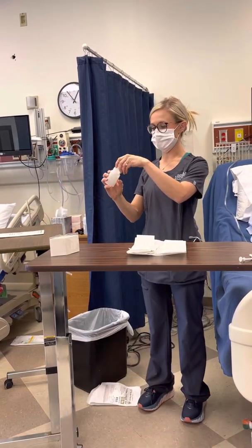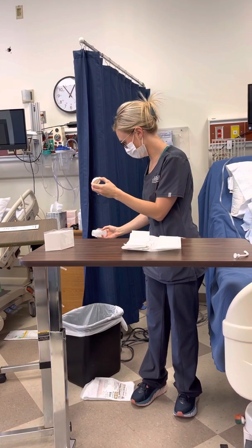This has already been opened and used, so before beginning, I'm going to make sure to label it.